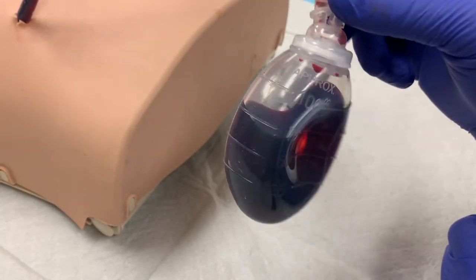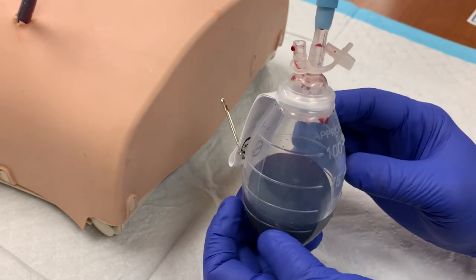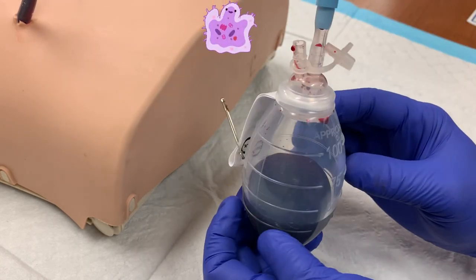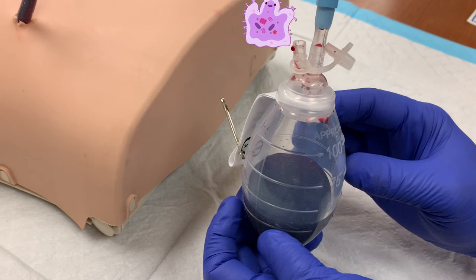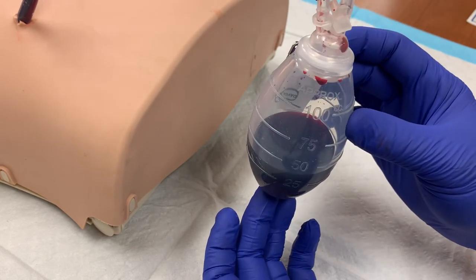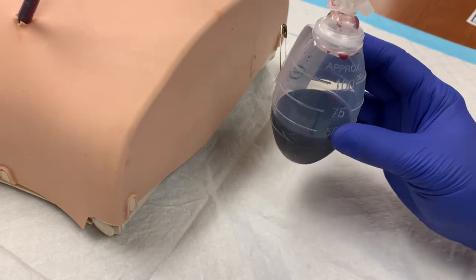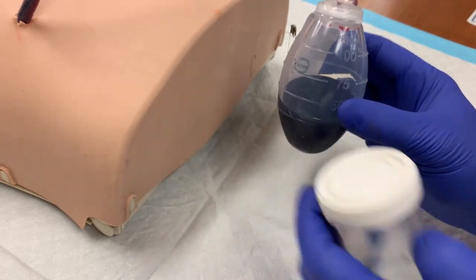Now it's time to drain the bulb. Release the spout — it is located near the drainage tube. The bulb will fully expand when the spout is open. There is now a direct and open path for bacteria to move into the patient's surgical site, so it is very important that you maintain aseptic technique to minimize this risk. Do not touch the inside of the plug or the spout opening with anything, including your gloved hand or the collection container.